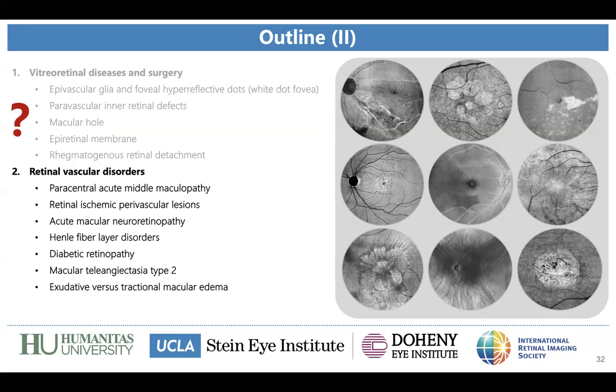Leveraging what Ricardo brought to light, the segmentation: from a research standpoint, how do you deal with the segmentation issues that we have mainly in wide slabs like 12 by 12, when the built-in software can't appropriately segment the OCT and OCTA? When you're dealing with high volume exams, where you need to do a lot of images, how do you deal with that?